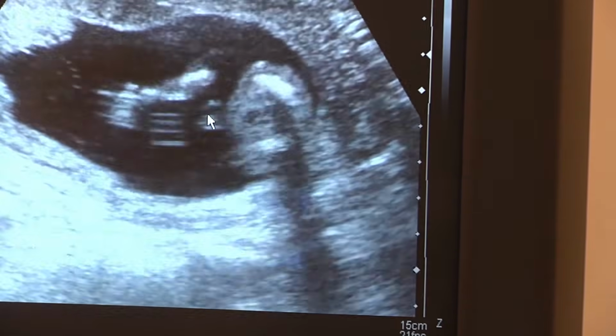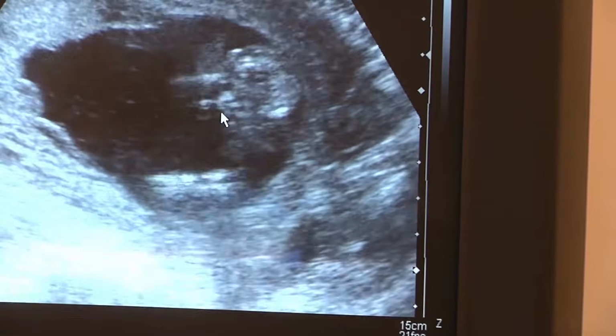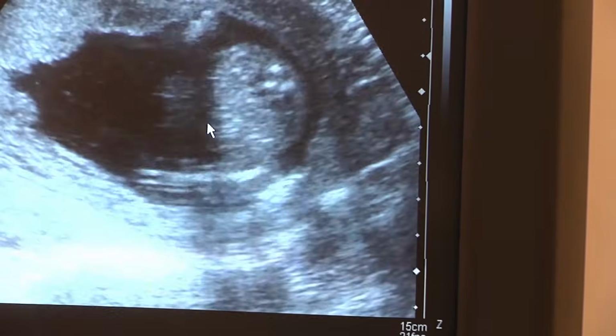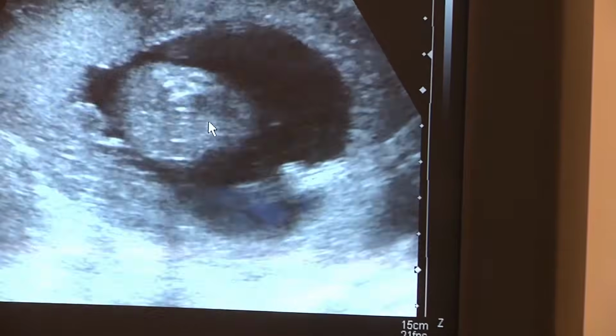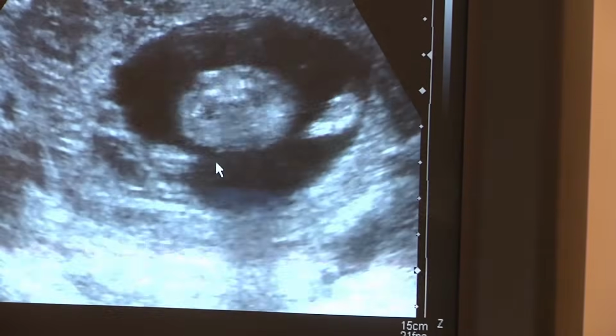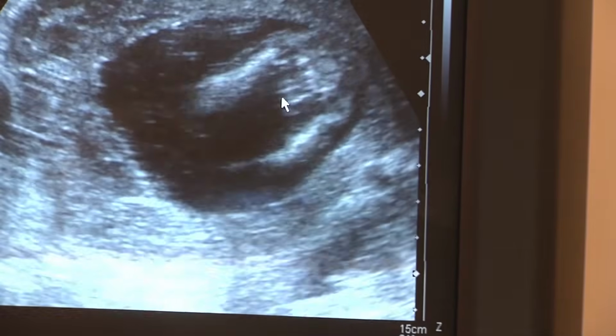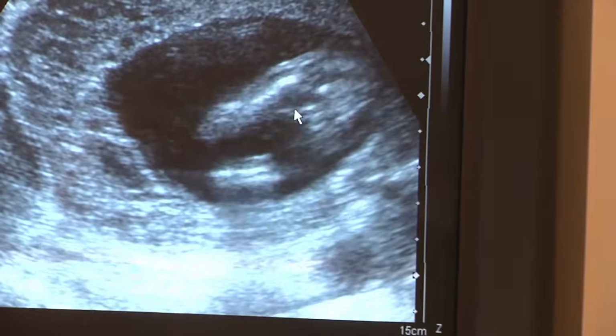Very modest. Okay, so here's between the legs. Here's the bladder, that black thing. That's the cord. A lot of times people mistake the cord for a penis, and you can't do that. And this little baby says, no, you're not going to see. Okay, right in there is where we look.